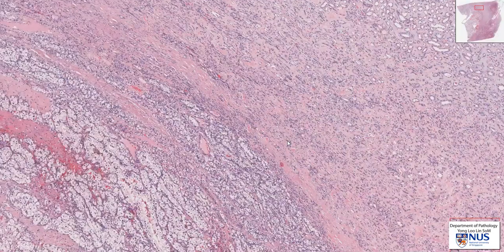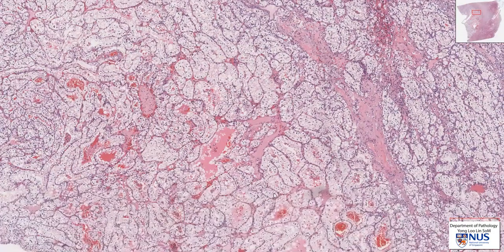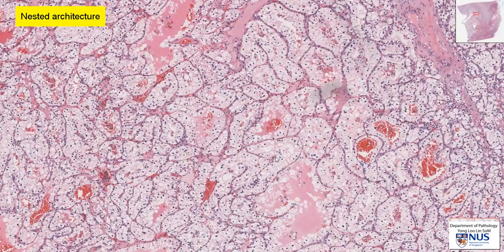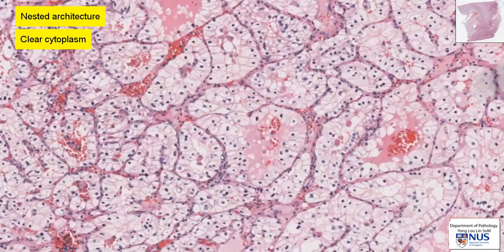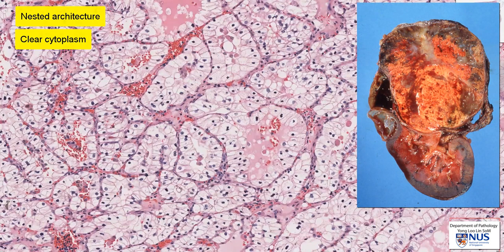Moving on to the tumor, we can see that it has a very nested architecture — very well-defined nests with delicate vessels in between. Within the nests, we can see that the cells are polygonal, there is abundant clear cytoplasm, and this is filled with glycogen as well as lipid, which gives the tumor this very bright yellow golden appearance grossly.